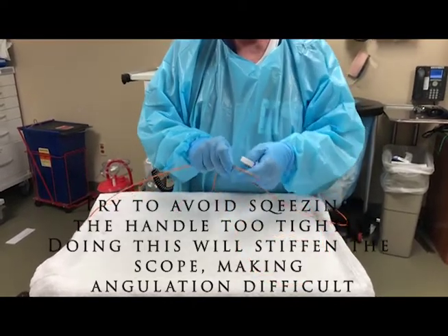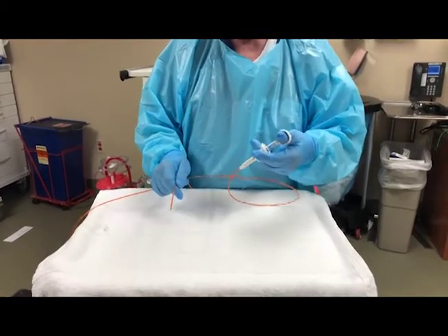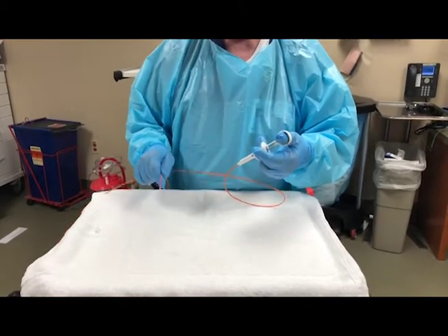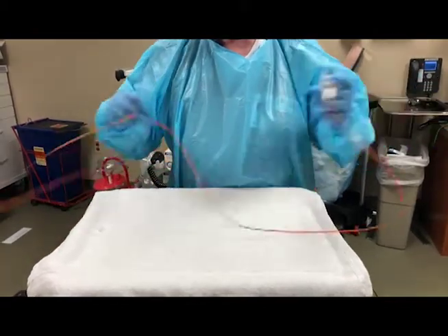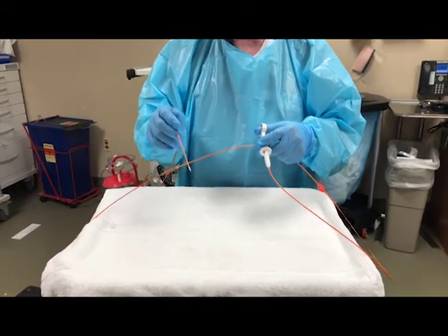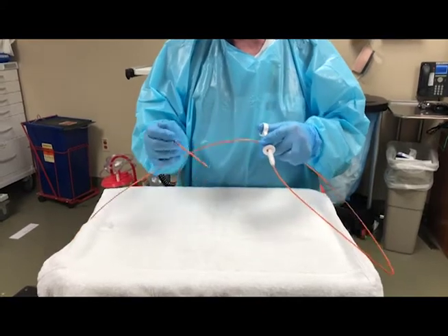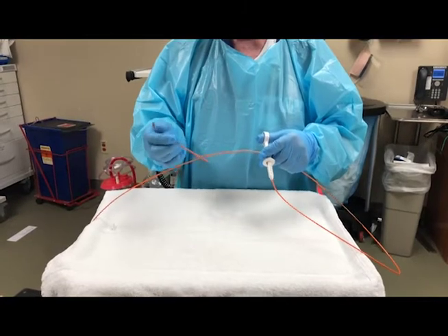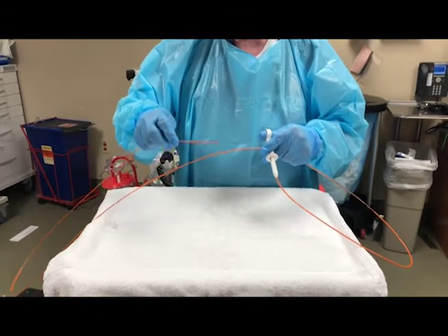Be careful when you're taking it out of the scope that you don't squeeze too hard on the handle, because that will make it especially hard to remove if the scope is retroflexed. Another thing to remember: when the endoscopist has the biopsy forcep in the scope and is trying to retroflex or get to a difficult position, do not squeeze hard on the forcep because it will cause it to stiffen, and when it stiffens it makes it harder to bend the scope.